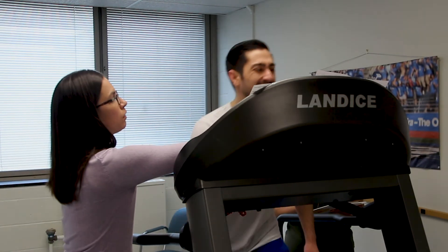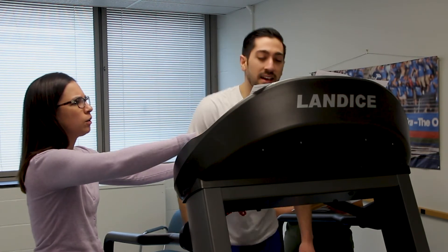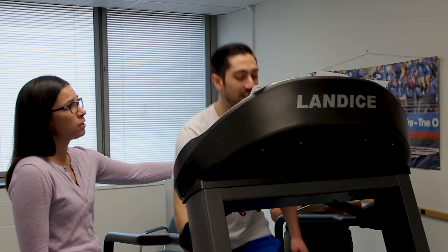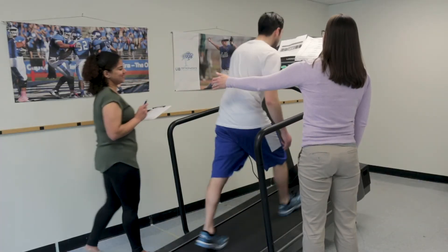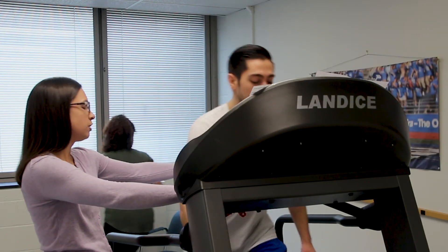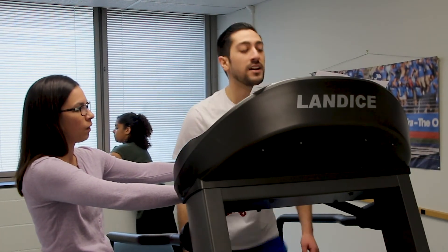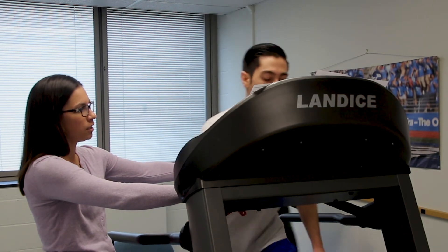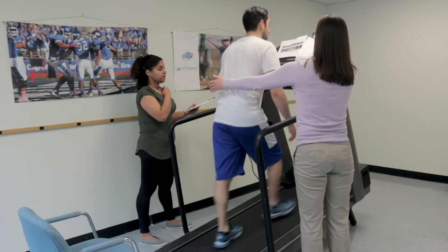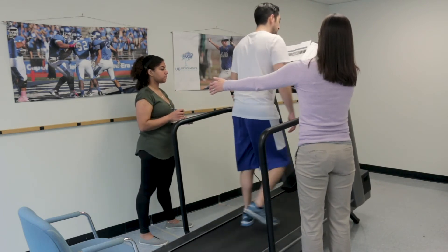How do you feel on our symptom scale now? I'm getting a tiny bit of a headache. So how would you rate that on my scale? About a 1. How hard do you feel like you're working? Around a 17 now. Do you feel like you could proceed to the next stage or should we be done for today? I think we could probably call it quits after this one. Okay, let's finish off this stage. First I'm going to decrease the speed and then decrease the grade. I'm going to decrease the speed down to 2.0 and hit the grade at the same time. Great job.